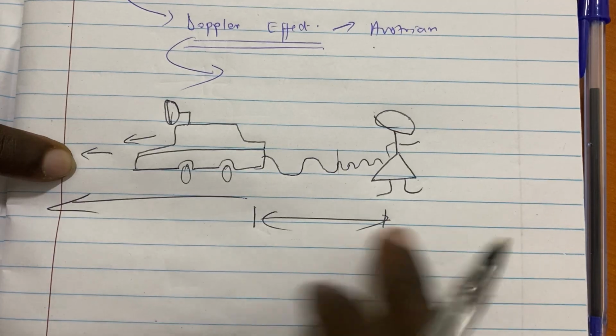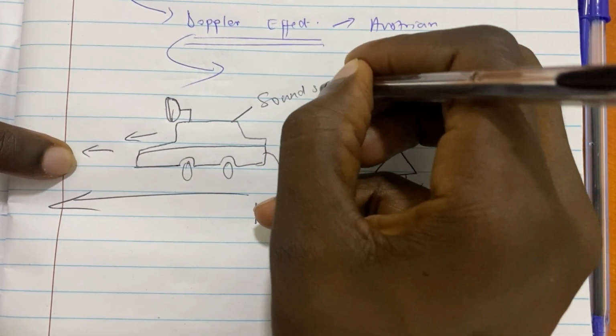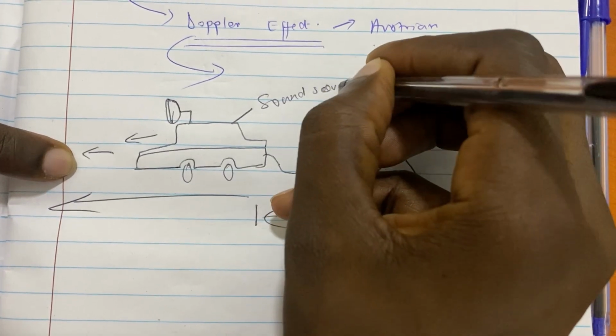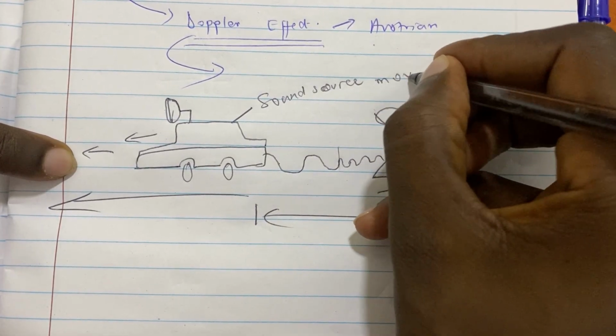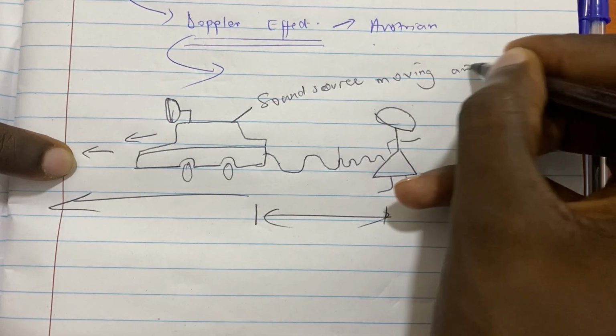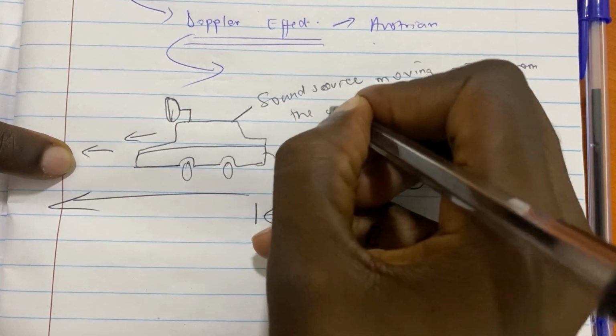So a sound source is moving away from the observer.